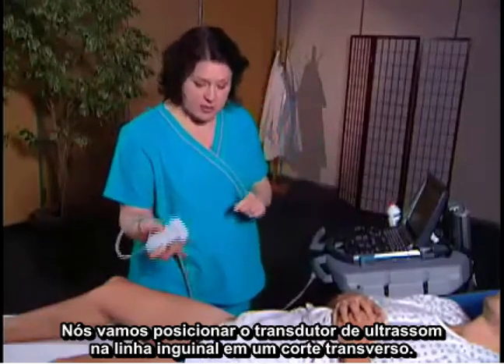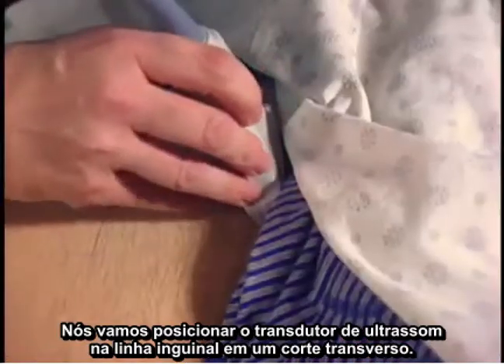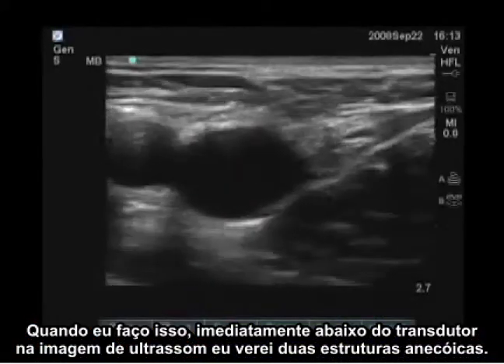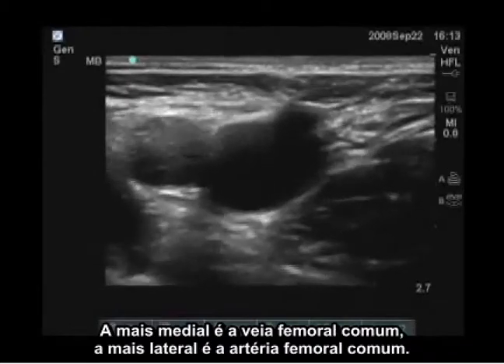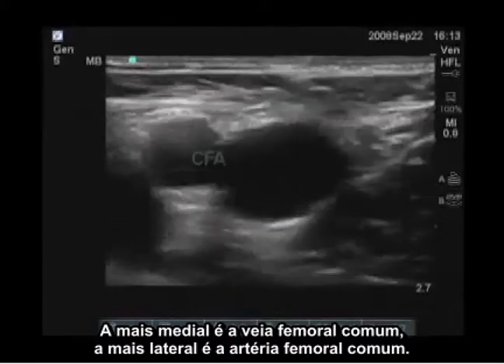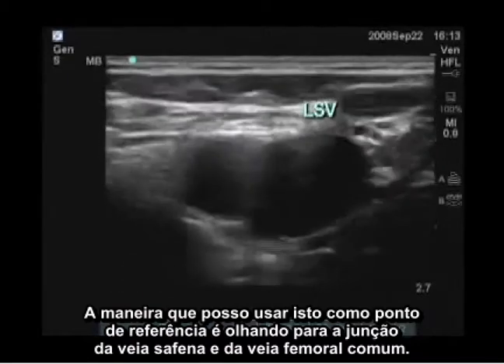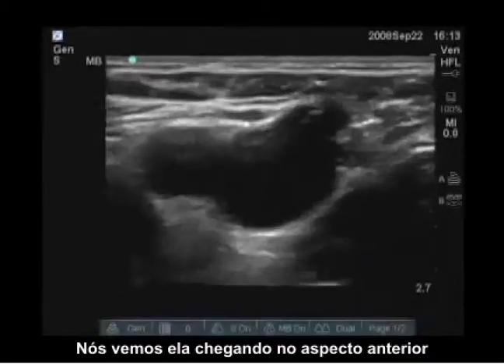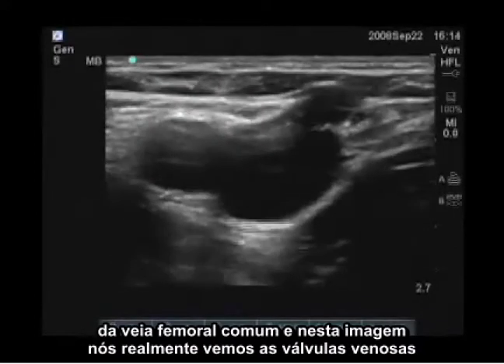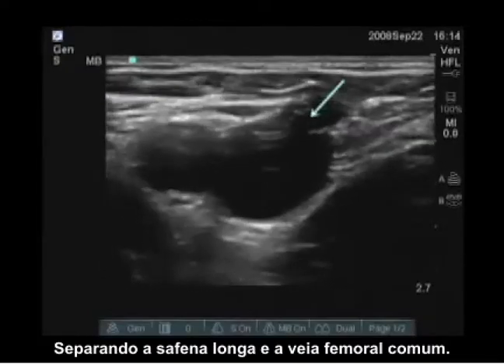We're going to place the ultrasound transducer at the inguinal crease in a transverse view. Immediately below the transducer in the ultrasound image, I'm going to see two anechoic structures. The one that's more medial is the common femoral vein, and the one that's more lateral is the common femoral artery. I can landmark this by looking for the junction with the long saphenous vein, which we see emptying into the anterior aspect of the common femoral vein. In this image, we actually see the venous valves separating the long saphenous and common femoral veins.